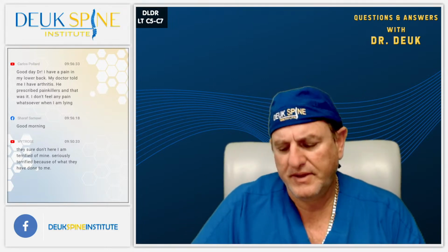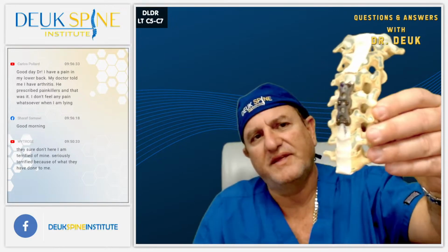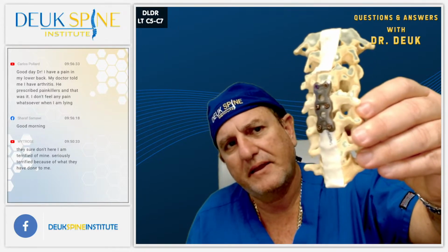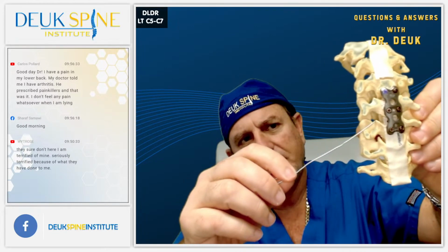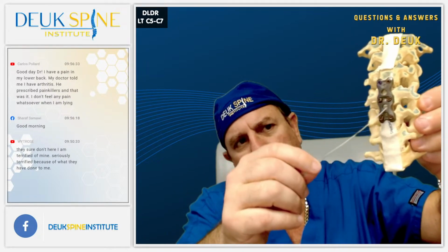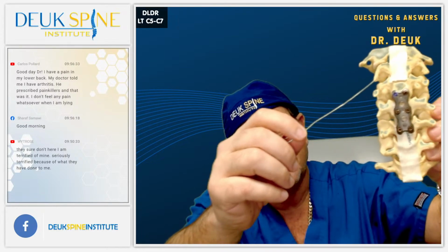And rather than doing a fusion surgery, which involves going in and removing the entire disc itself and getting to the herniation in the back, putting in a cage made out of plastic or PEEK, it's really carbon, but we call it plastic anyway. You can see that cage right there. and then putting a metal plate over it. So this patient would have had 2 discs removed, cages and a metal plate.